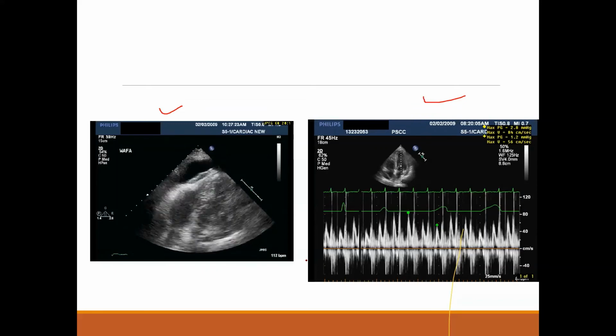This is pericardial effusion. Atrial fibrillation. Yes. Pericardial effusion. Look for the variation, systolic and diastolic variation, with a likelihood of RV diastolic collapse. It might not be so clear here, but I always do M mode of the RV free wall to see the diastolic collapse. But it might be here, by the way. So this one is showing large effusion here, and we also have a possibility of RV diastolic collapse.